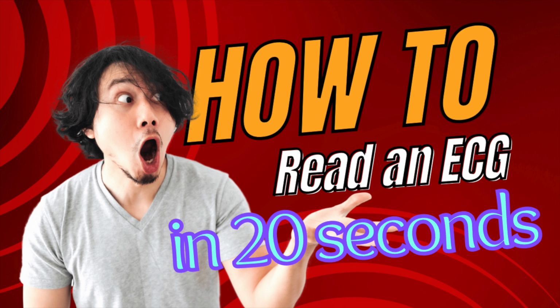You do. And this is where that accurate EKG interpretation becomes absolutely crucial. Dr. Barai points out that giving nitroglycerin, which is often used to treat heart attacks, would actually be really dangerous in this particular situation. It could cause a big drop in blood pressure, which would make things even worse for the heart. Wow. So one little detail on the EKG can completely change the course of treatment, potentially even save a life. Exactly. It really shows you the importance of that accurate interpretation. It's like finding that one missing piece of a puzzle, you know? Yeah. The one that helps you see the whole picture.